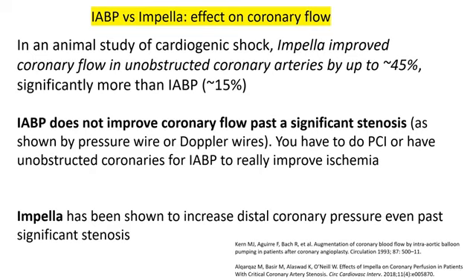So the way balloon pump works in those cases is similarly to giving the patient nitroglycerin or calcium channel blockers. It reduces myocardial O2 demand via improving afterload and indirectly preload. It's also like giving the patient beta blocker. It's making the heart function better with less oxygen. And the advantage of balloon pump in that scenario is that you're not risking dropping the pressure like with nitroglycerin or calcium channel blocker. You're actually improving the blood pressure while reducing myocardial ischemia. So that's the reason we use balloon pump in that case.